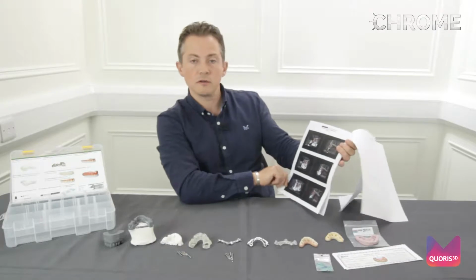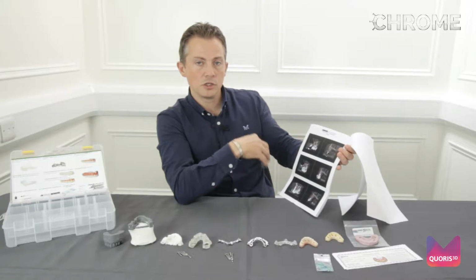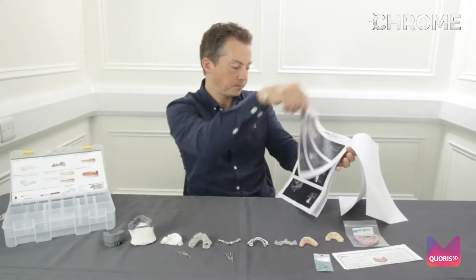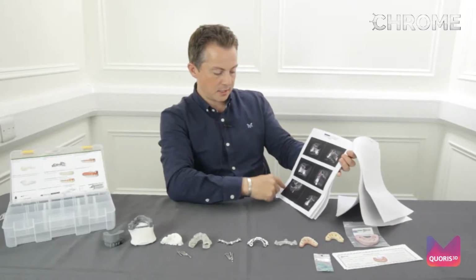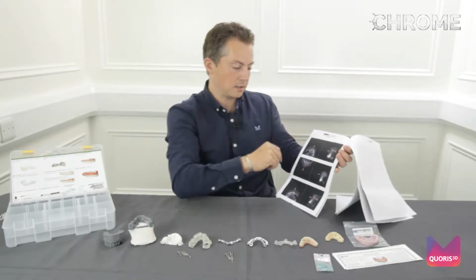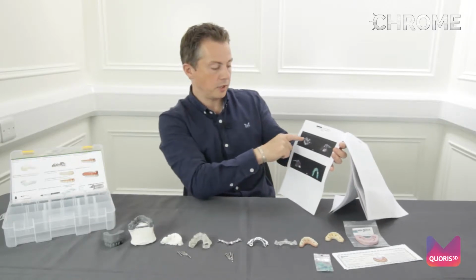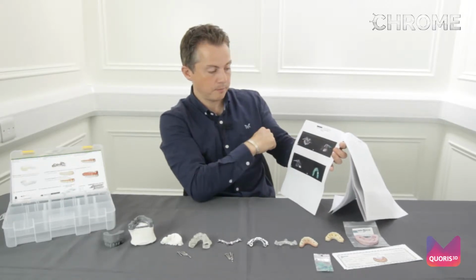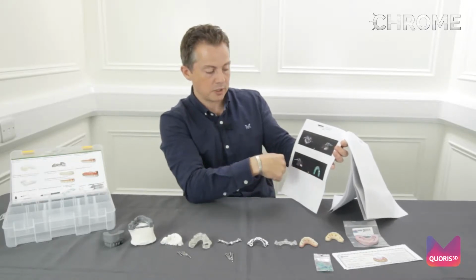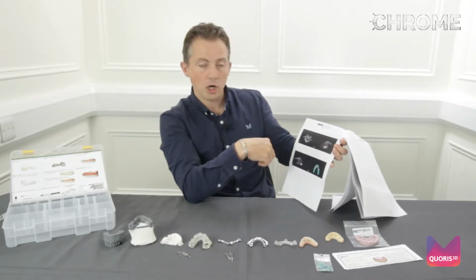And then it goes on just to give you images of each of the implants that you have approved as the lead clinician during your online meeting. And it runs through exactly where the implants are being placed in each site, and also shows you the fixation pins as they are placed, in this case, in the maxilla. And at the end, you have a diagram showing each of the implants in place, the fixation pins in place in 2 different planes, and also your final provisional restoration, and the draw through the implant, or through the restoration of your abutments.